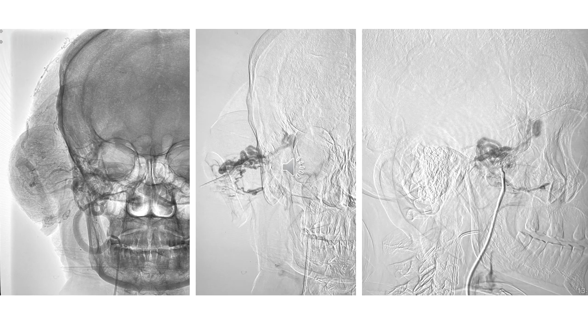On the first image on the left side of the screen, we can see the tumor enhancement overlying the bones of the craniofacial region, which is just given here to depict the extent of the tumor vis-a-vis the bony structures. The middle image is an anteroposterior DSA run with a puncture needle placed in the center of the tumor, and contrast has been injected to delineate the tumor. The same is seen on the lateral frame. So this is a biplane DSA run, a direct parenchymogram with direct puncture of the needle.